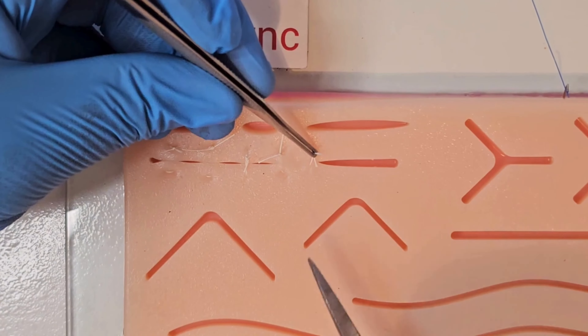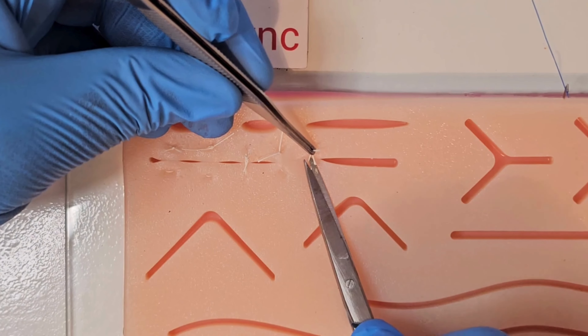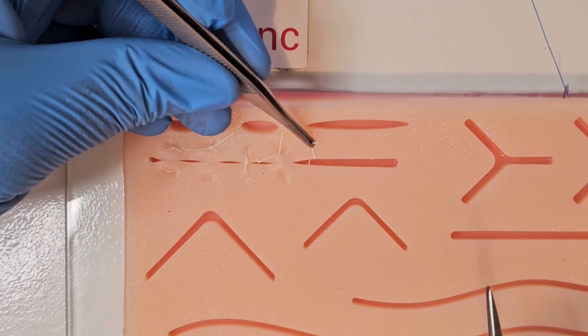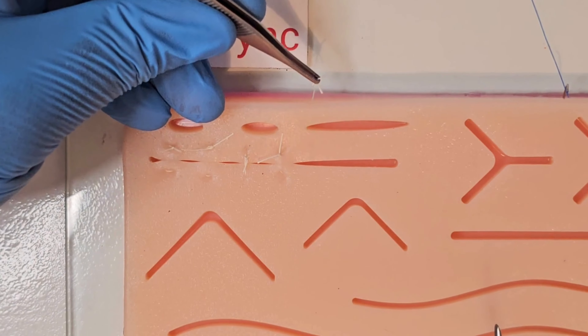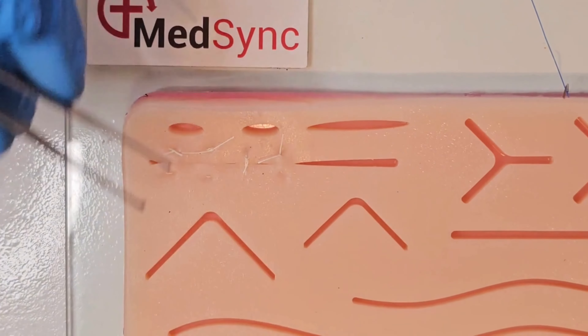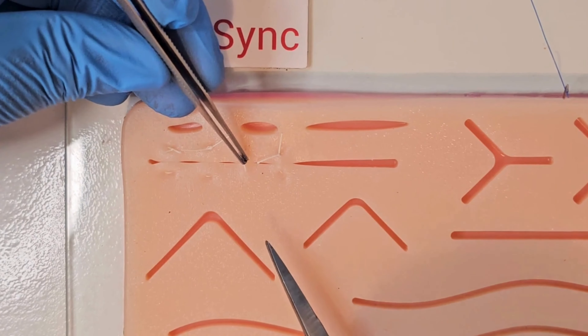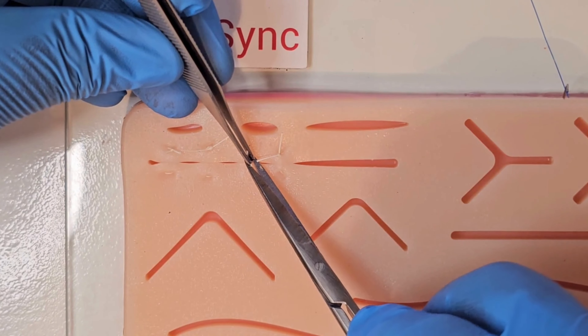Removal of sutures is performed by cutting at the base of a single strand of suture flush with the skin. This means when you pull the suture out, no suture that has been facing the elements outside the skin will be dragged through the wound. When performed in this way, you reduce the risk of taking bacteria through the suture tract.